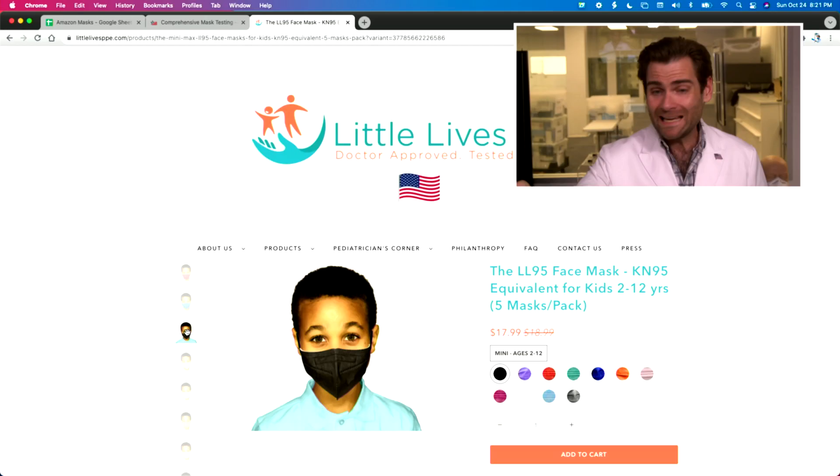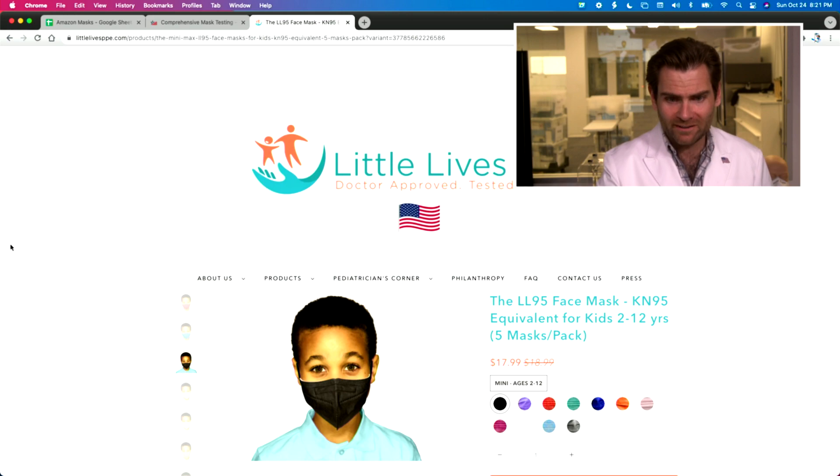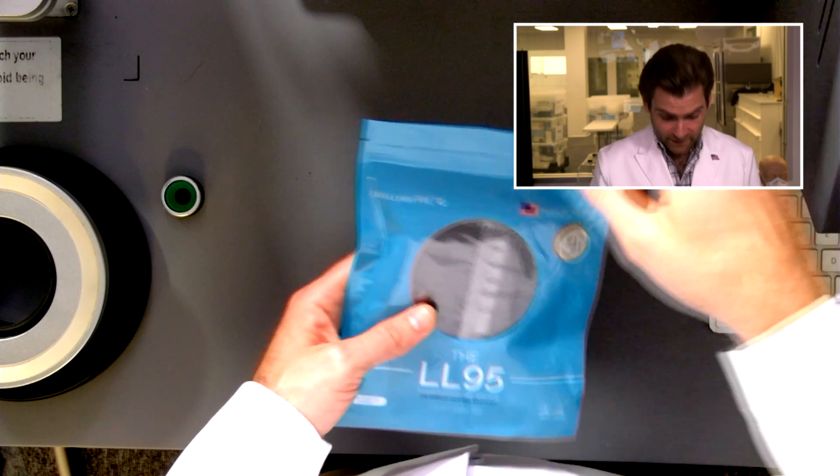Hey everyone, welcome back. We're testing every single mask we can get our hands on. Today we're looking at the Little Lives PPE 'I Make My Head Smaller' mask — it seems advertised all over the place. I wanted to find out what all the rage was about, so we bought some. Let's open it up and get it in the clamper.